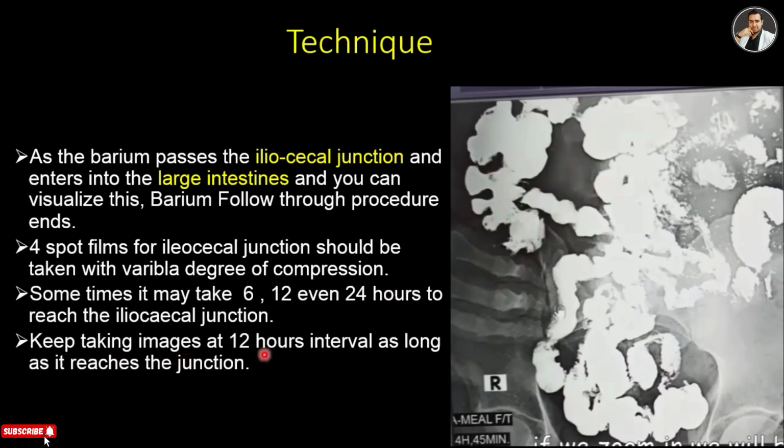And keep taking images at 12 hour intervals as long as it takes to reach the junction. So sometimes you can see that after 6 hours, contrast didn't reach the ileocecal junction, and even after 12 hours contrast didn't reach the ileocecal junction. So you have to take an image the next day, a 24 hour image, to see how the contrast reached the ileocecal junction.